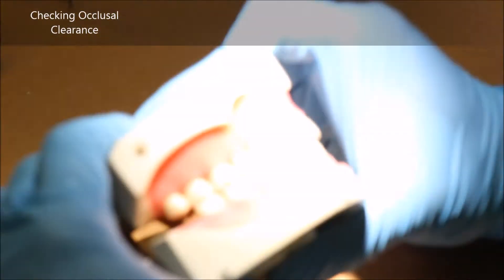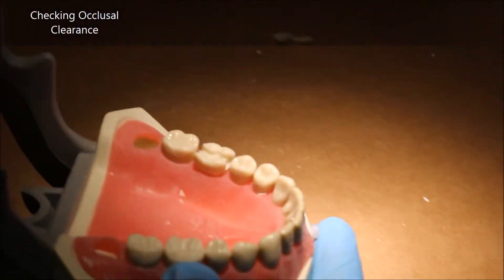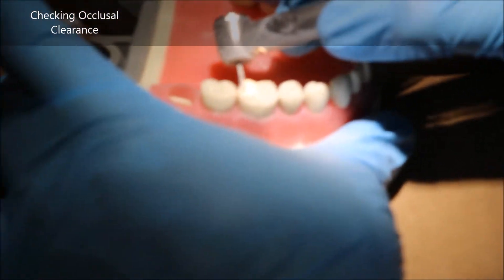At this point, you're going to find your maxilla and place both together to check for occlusal reduction. As you can see, I do not have that much — because I did not make my functional cusp bevel as heavily as I should. A very common mistake.